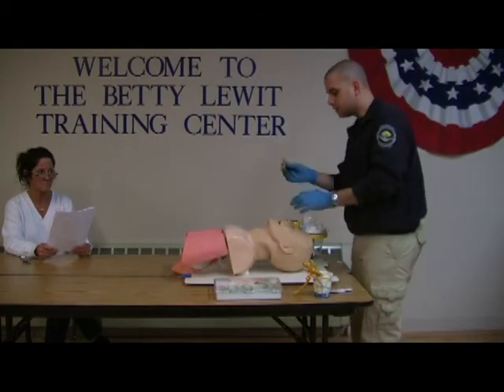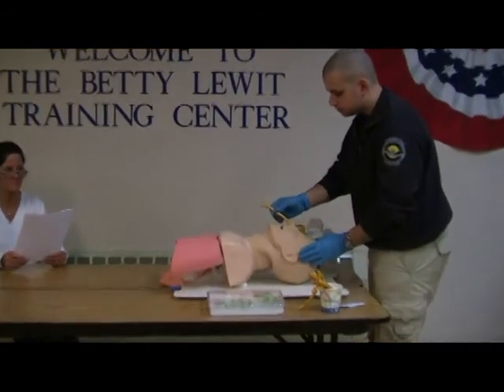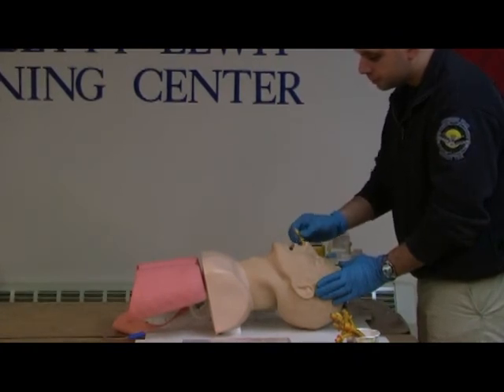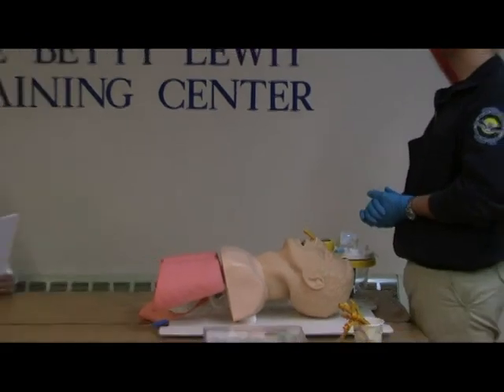I am going to take the NPA, bevel it towards the septum, and insert it using the right nostril. My airway is in place. Are you done? I am done.